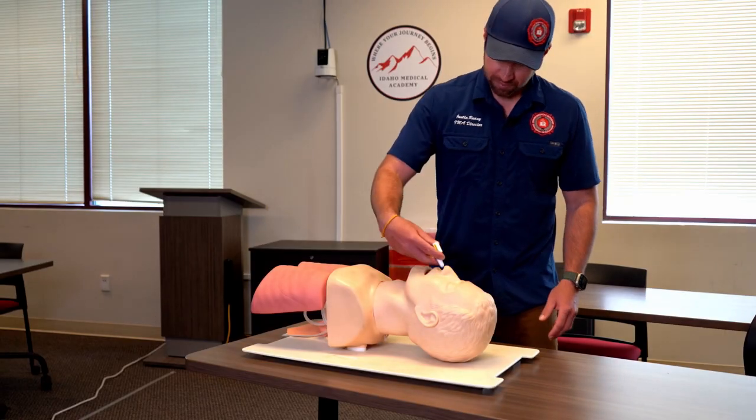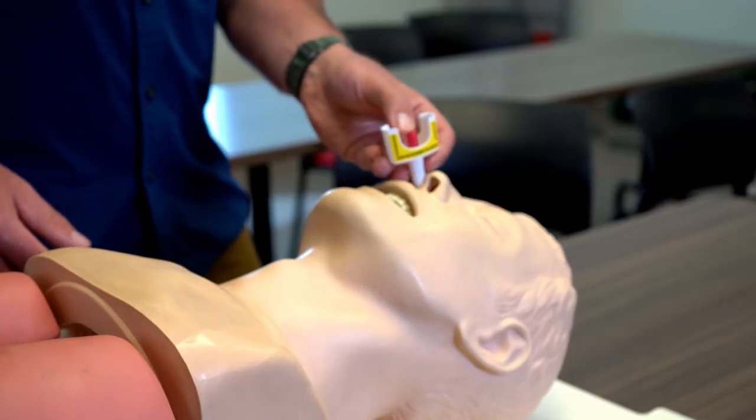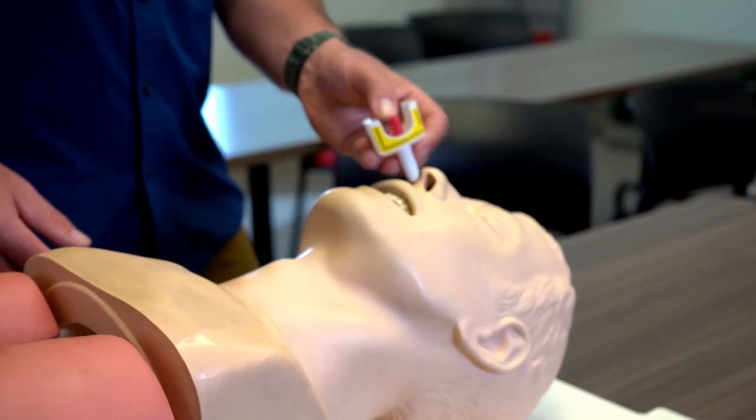How to administer Narcan: you grab the plunger, you're going to put it into the patient's nose, and you're spreading the mist in the back of the patient's nose like you would do for any nasal medication. After that, it's really important to call 9-1-1 and have this patient transported to the ER for further evaluation.